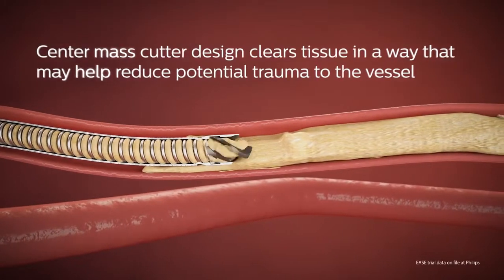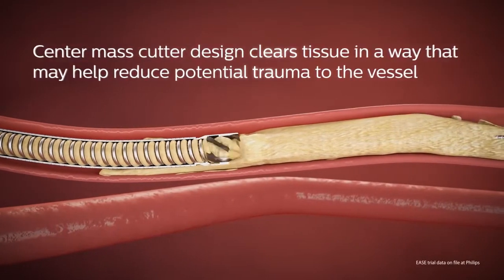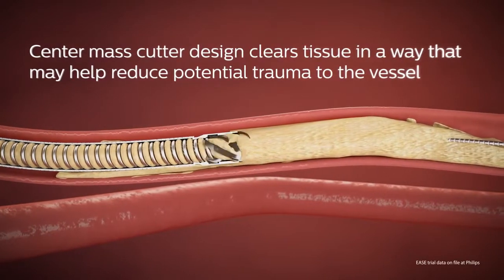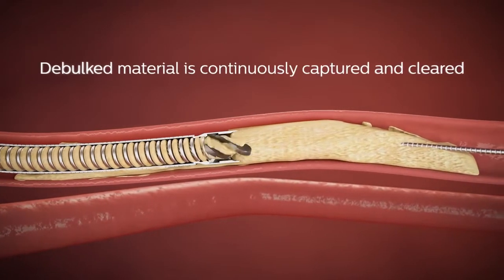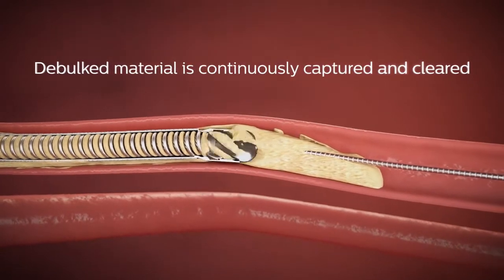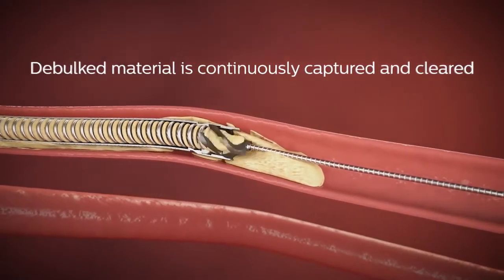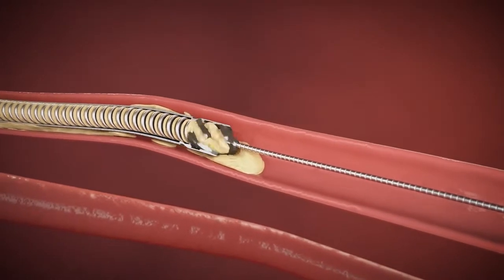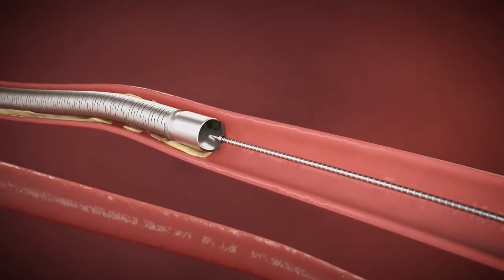The center mass cutter design clears tissue in a way that may help reduce potential trauma to the vessel. As the cutting element rotates, disease is debulked at a controlled diameter and is continuously captured and cleared from the body. This allows for blood flow to be quickly restored to the distal vessels.